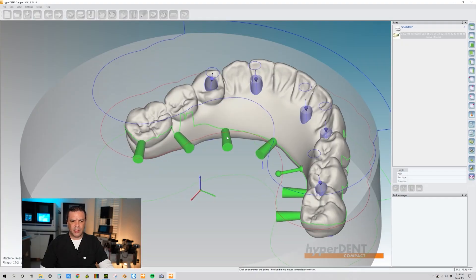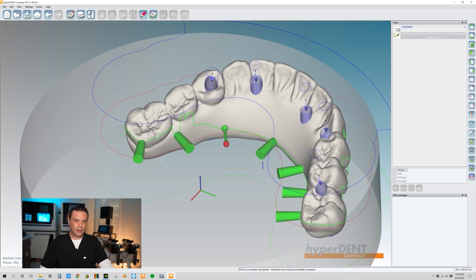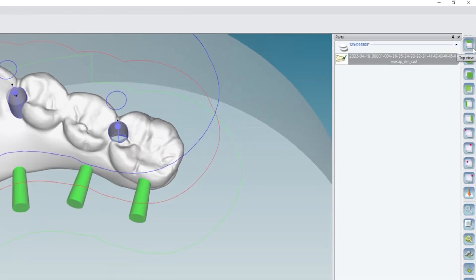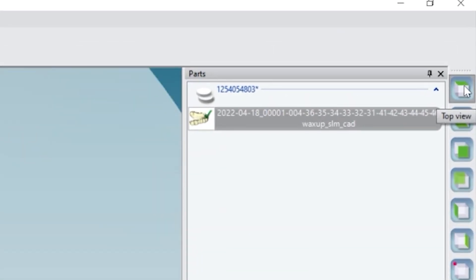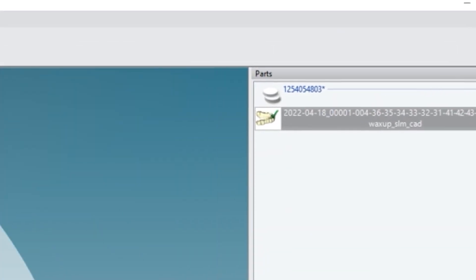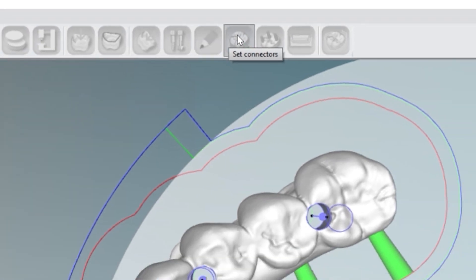This connector is a little below the waterline, so easy quick fix. Double click on it. Just drag it up. Okay, perfect. Now click on this button to get yourself a top view. Go ahead and go back to set connectors.